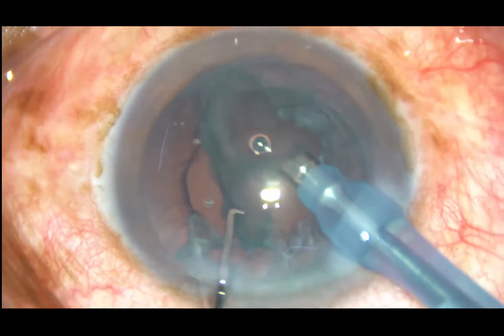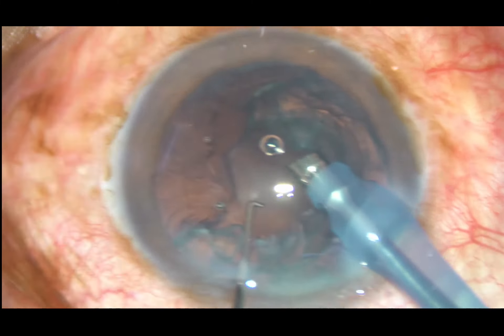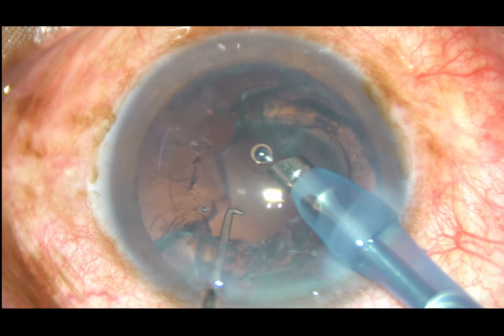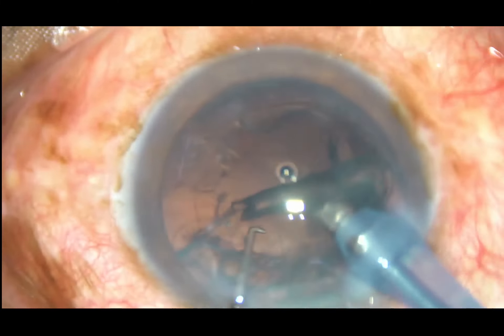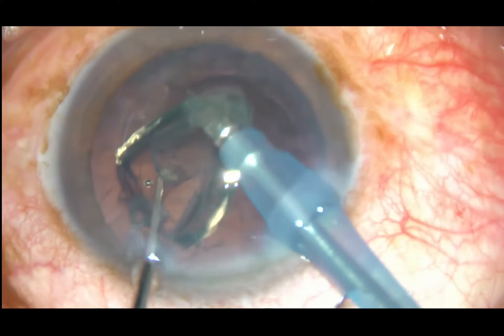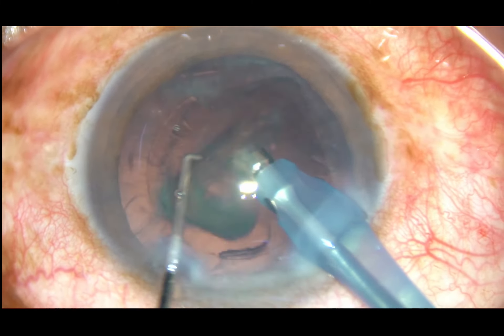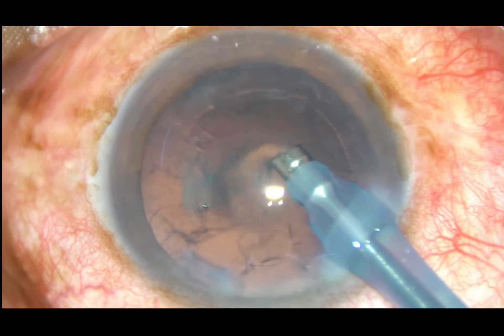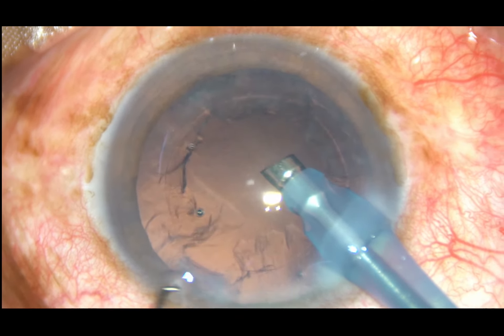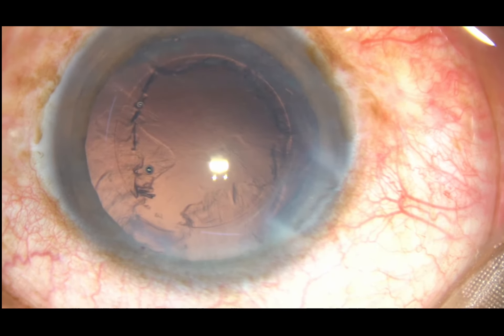Now for the epinucleus, use only vacuum at this time, bring it to the central part and then apply energy. You can go to epinucleus mode and remove the epinucleus. Nucleus and epinucleus have now been removed.